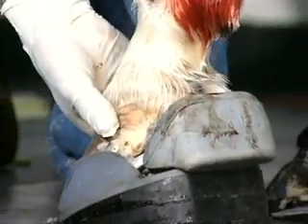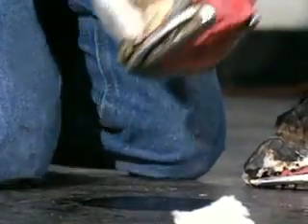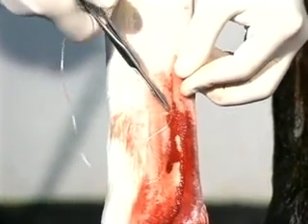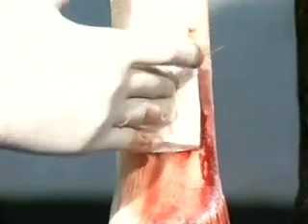Notice the ends of the deep flexor. The wedge is still on. I'm going to have my assistant slip the ultimate off, and watch what happens to the ends of the deep flexor. Now the lower end has dropped down approximately an inch and a half. This will show you clearly the effects of using the ultimates to reduce the strain of the deep flexor in acute laminitis. I usually just put in a mattress suture. One stitch is all you need. It's quite an easy technique — very straightforward and very low risk.